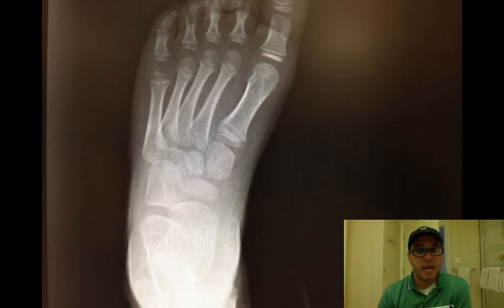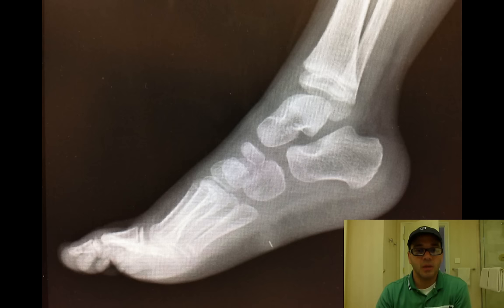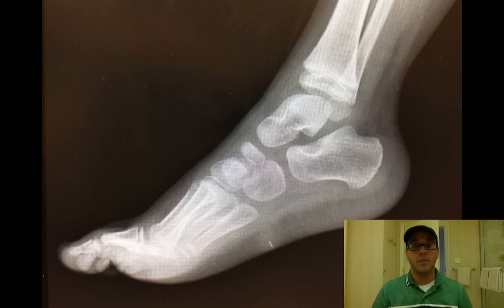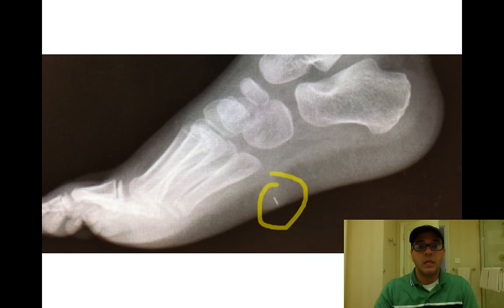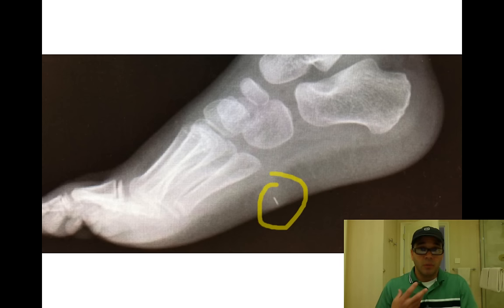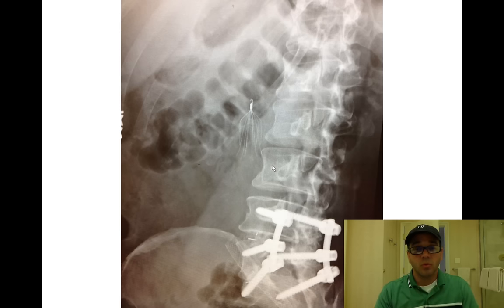Next is a foot X-ray. Look right in the middle of the foot — there's a density there. On the lateral view it's clear and obvious: it's a foreign body on the plantar side of the foot. The patient stepped on a nail, needle, or something similar. It obviously needs to be removed to avoid infection. This one was fairly superficial, so we were able to remove it in the emergency department. When they're very deep, sometimes we have to leave it for a podiatrist or orthopedic foot surgeon due to risk of damage to deeper structures and tendons.